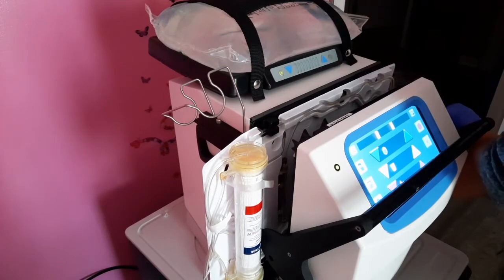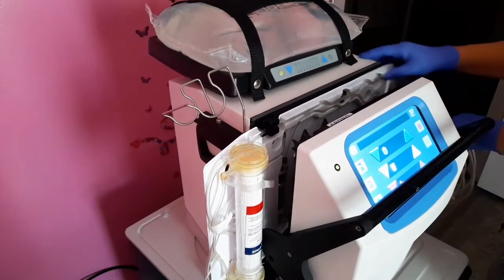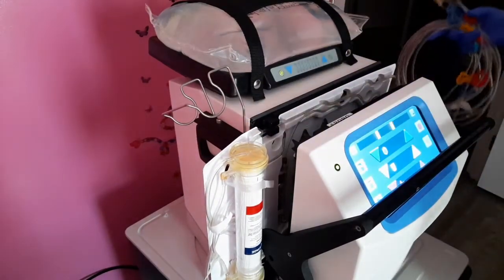And you just do the same thing, just push it right in. It should slide right in there. You should be lined up with it perfectly. Okay, once you get this one in, the other one should line up perfectly.